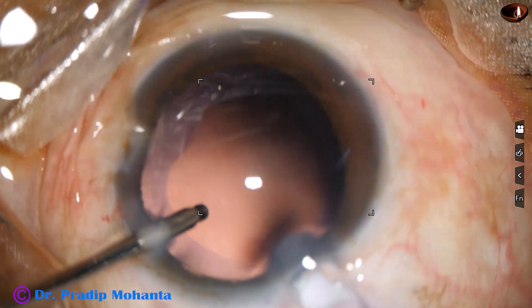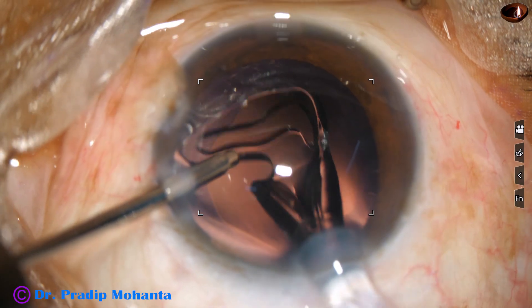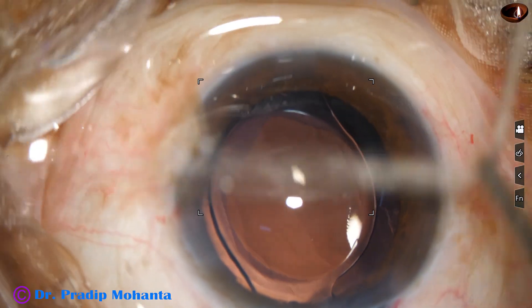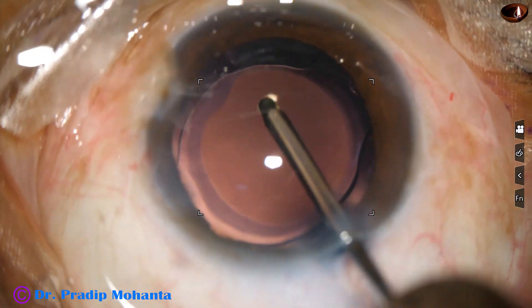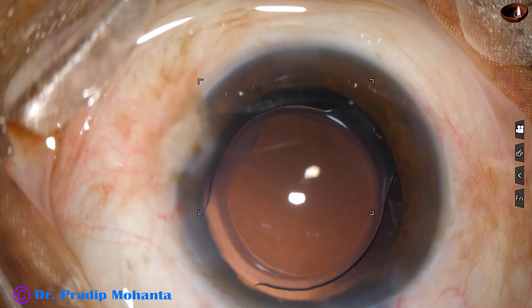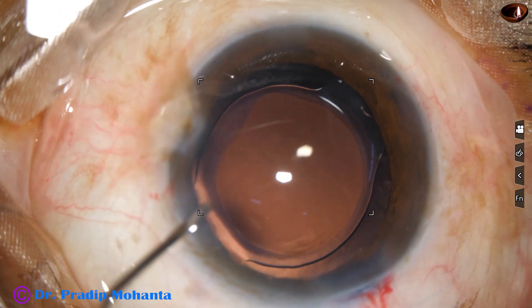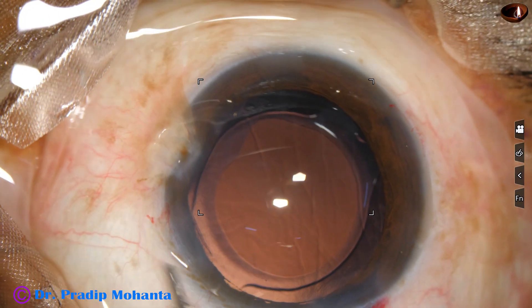This is hydro implantation of a single piece monofocal intraocular lens. The leading haptic goes into the capsular bag and just by a tap with the left hand instrument, the trailing haptic also goes into the capsular bag. We can see that the optic of the intraocular lens is nicely overlapped all around by the rhexis, so the rhexis is ideal.